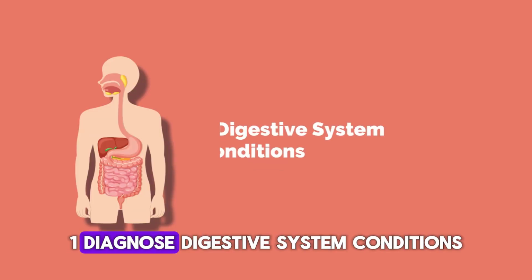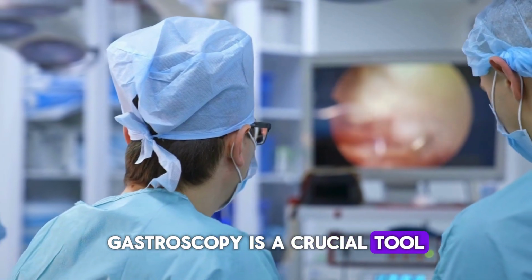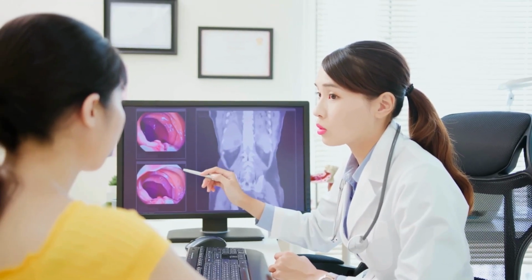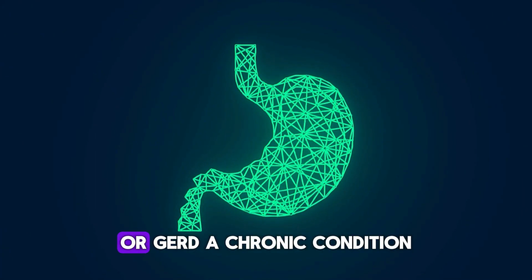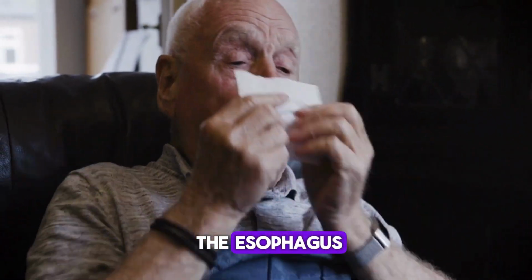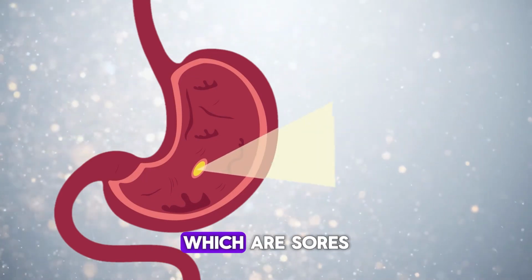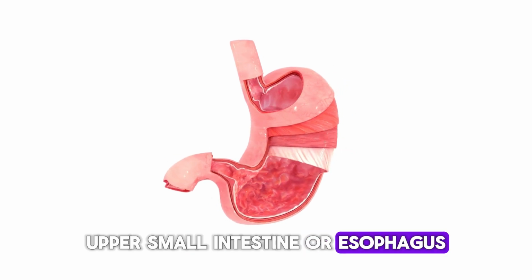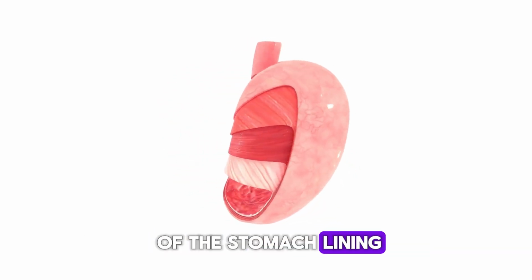1. Diagnose digestive system conditions. Gastroscopy is a crucial tool in diagnosing various conditions that affect the digestive system. For instance, it can help identify gastroesophageal reflux disease, or GERD, a chronic condition where stomach acid frequently flows back into the esophagus, causing irritation. It can also detect ulcers, which are sores that develop on the lining of the stomach, upper small intestine or esophagus, and gastritis, an inflammation or irritation of the stomach lining.